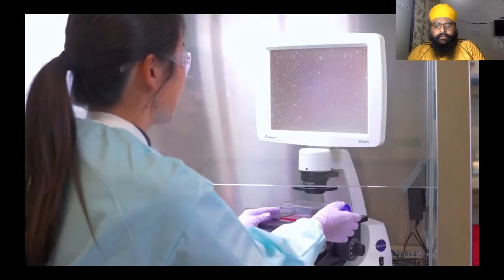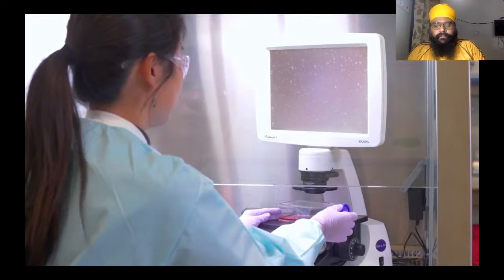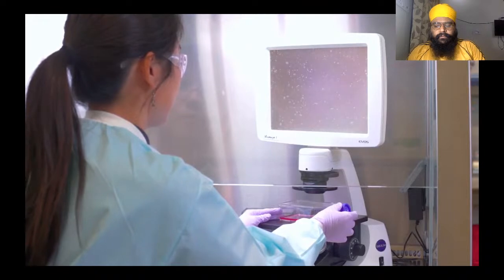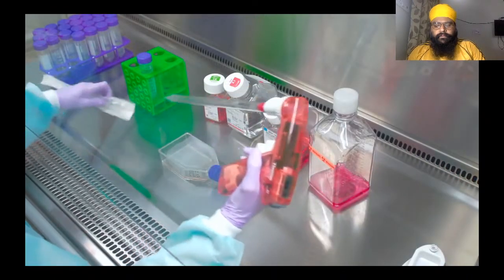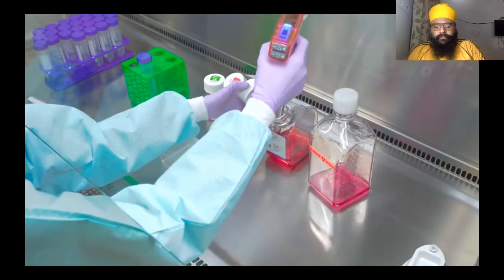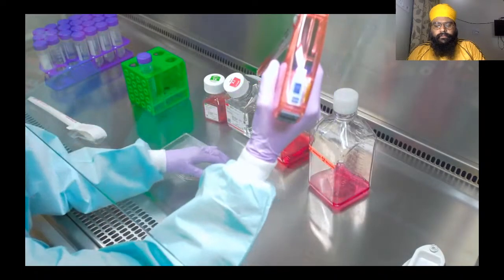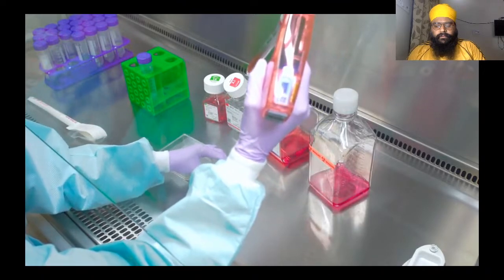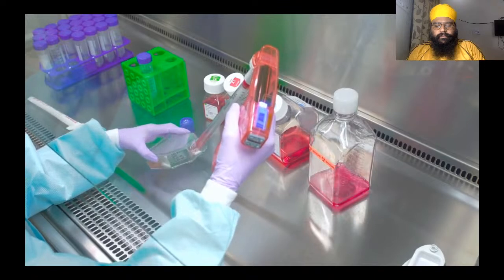Use a microscope to confirm the cells have released from the flask. They will start to appear round as they release from the substrate, and will move or slide when the flask is tilted. Complete dissociation is necessary. Do not leave the dissociation reagent on too long, especially if you're using a reagent other than TrypLE. You may choose to manually break up lingering clumps by repeatedly pipetting warmed medium over them. A single cell suspension is important to achieve an accurate cell count.